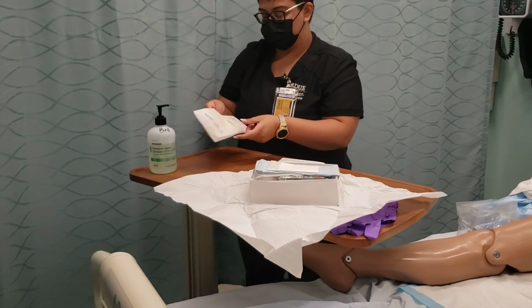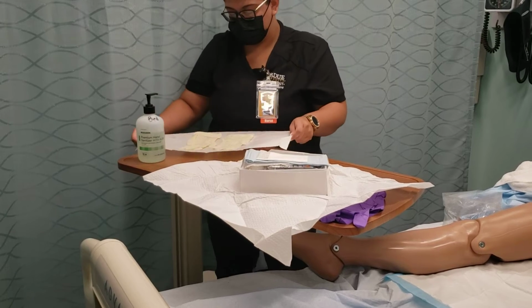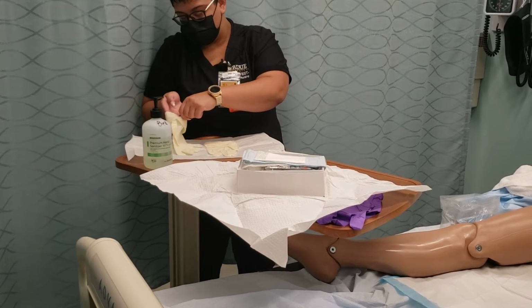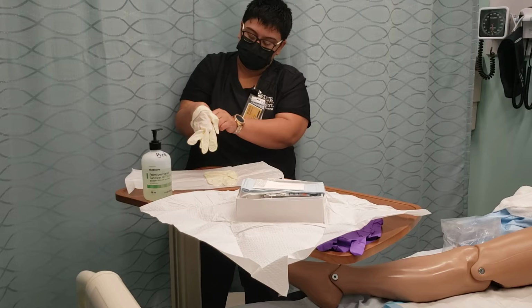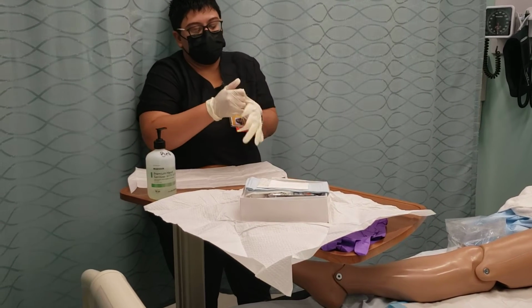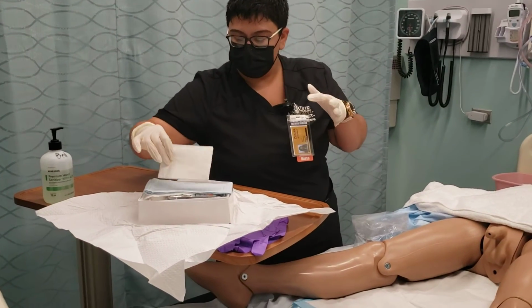Now I'm going to set up my sterile field.